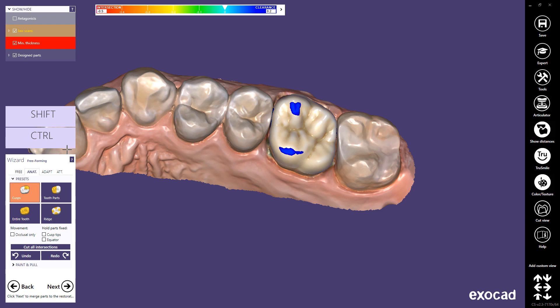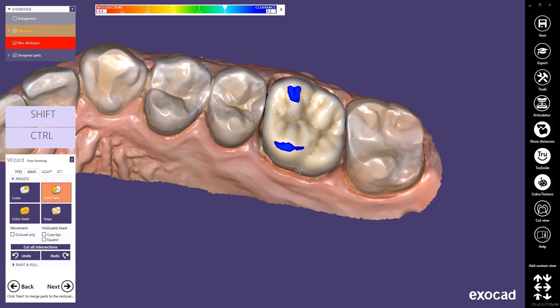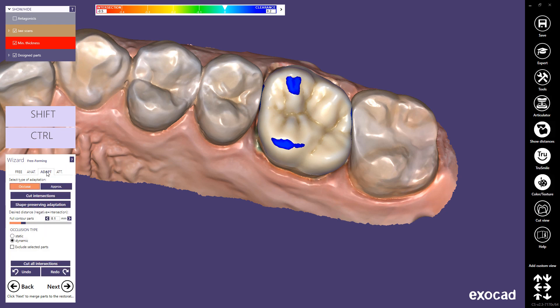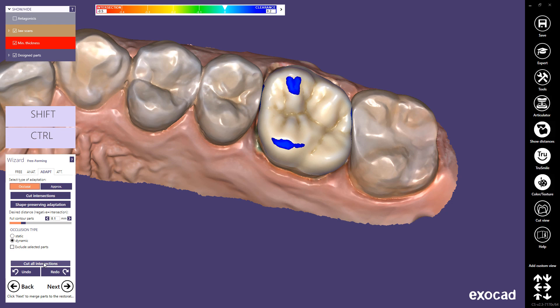You can also edit the tooth shape with free-forming tools. Anatomical free-forming allows you to adjust the tooth anatomy by tooth area. If you wish to have further adaptation, select the desired adaptation type in the occlusal or proximal area. To cut intersections according to the selected area, click Cut Intersections. Or you can cut all intersections with the antagonist and the adjacent teeth at the same time.